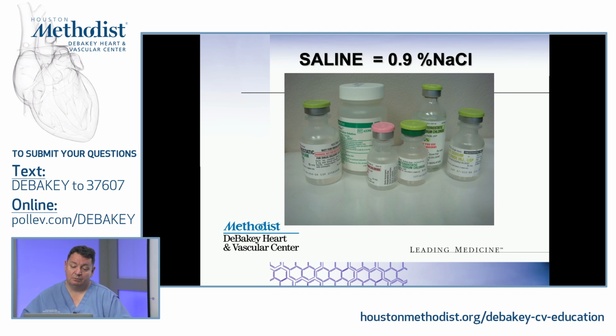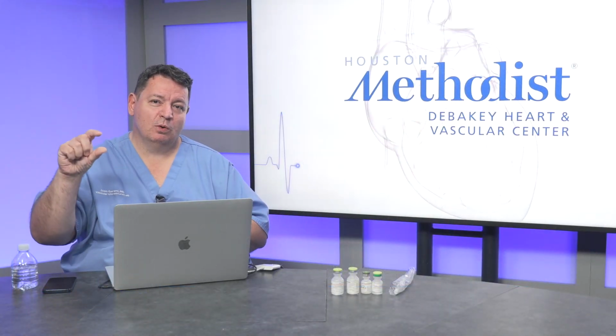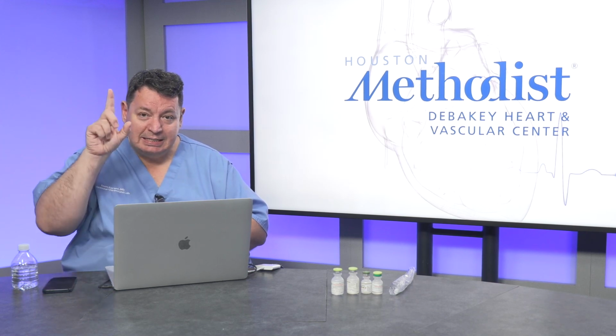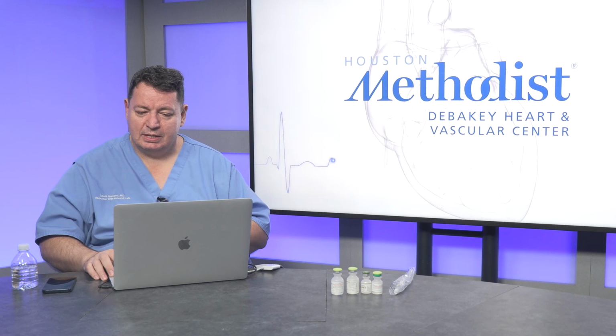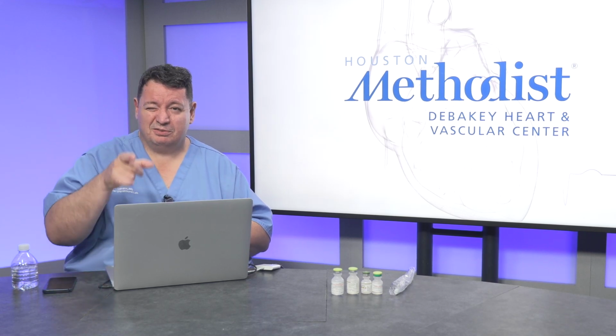When COVID started, we started to pay attention that we started to see microembolus signal on a venous study. So on a venous waveform, if we decrease the gain, we also started to see the same tiny white signals, and I'm able to show you one or two. So thank you for your question, because that is a very good question.